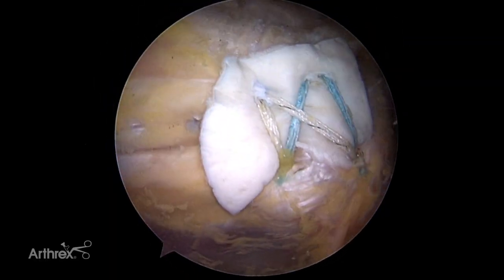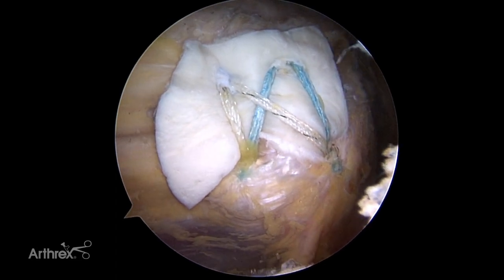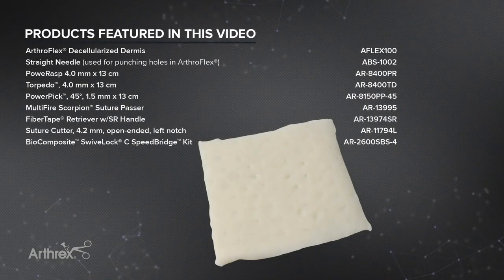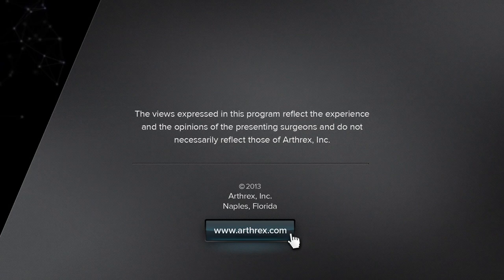This completes the knotless speed bridge repair augmented with ArthroFlex Acellular Dermal Extracellular Matrix.